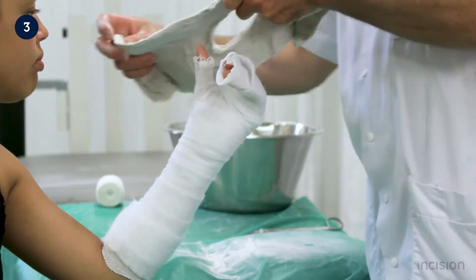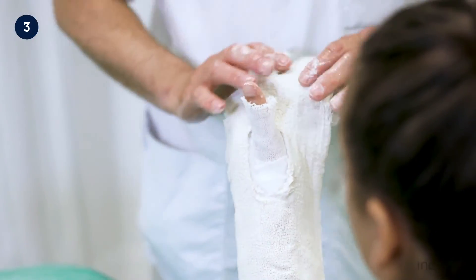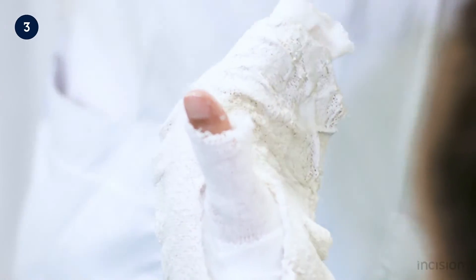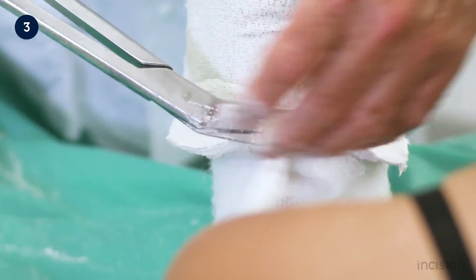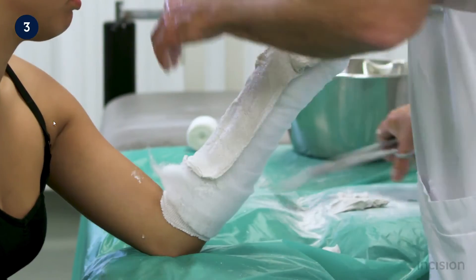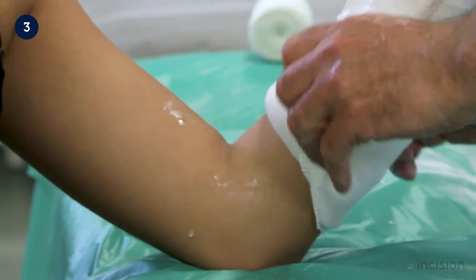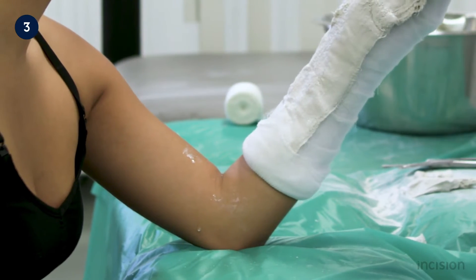The plaster is then applied over the radial side of the forearm and trimmed if it is too long, both distally and proximally at the elbow joint. Thereafter, the plaster is smoothed over the forearm to remove any wrinkles, with care taken to ensure no skin comes in contact with the plaster.